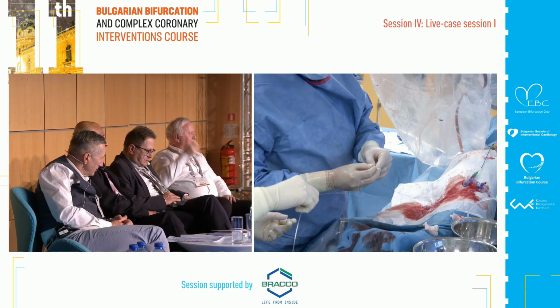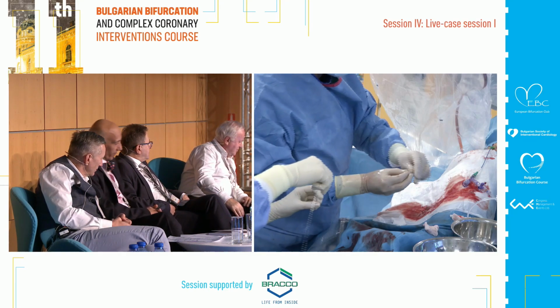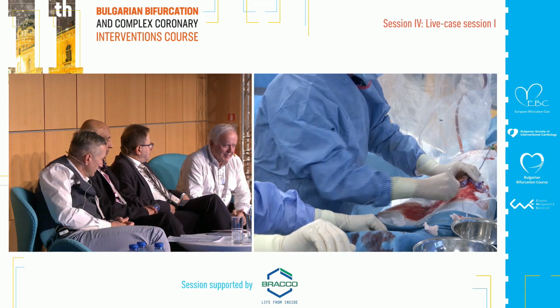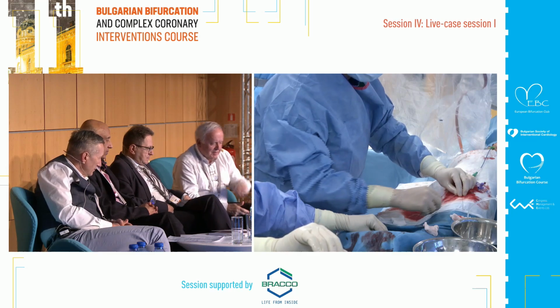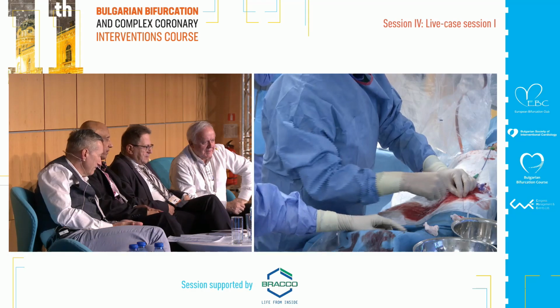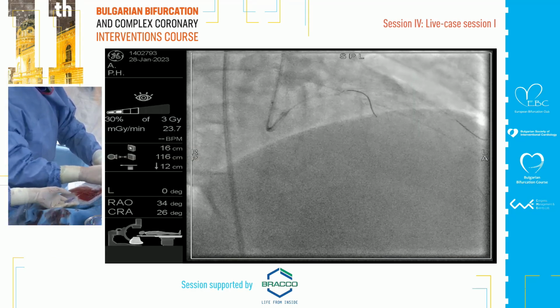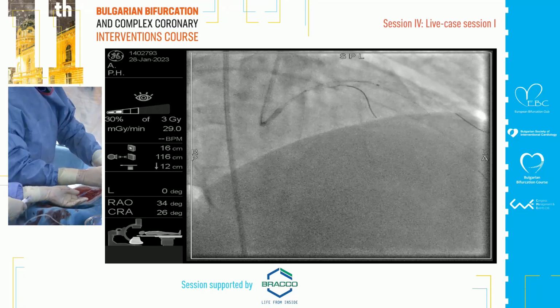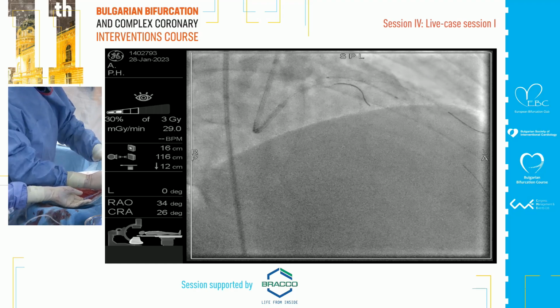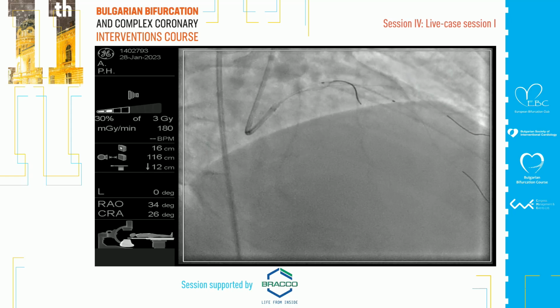Okay, we change a little bit our mind because we're considering that afterward we connect the stent on left main to this one. We took a slightly longer one, 2.5 by 28, in order to facilitate connecting the stent on left main with this one. Yeah, we'll be fine. And after that, you will do something on the diagonal?